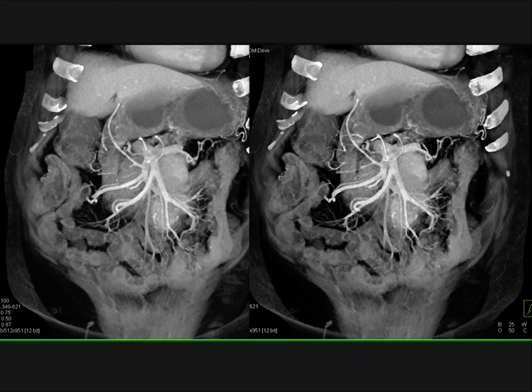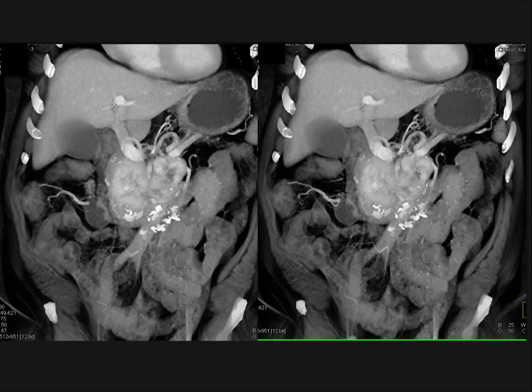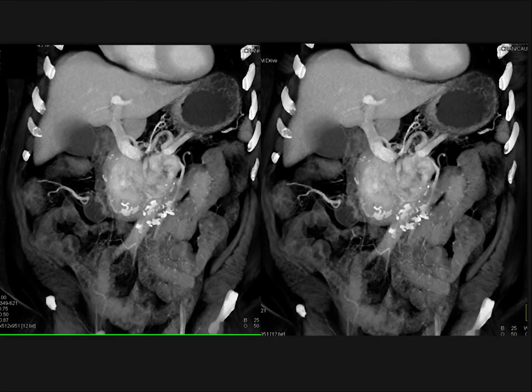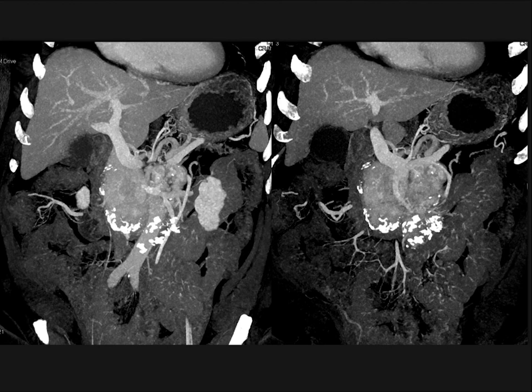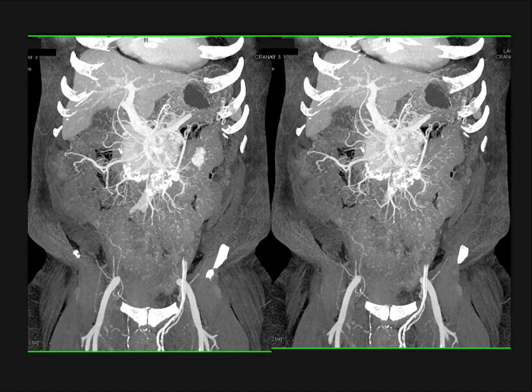And here it is again, just some additional images. So I think the appearance of these tumors is variable, from polypoid lesions to infiltrating lesions to bulky lesions with large necrotic nodes, with the nodes being vascular, nodes involving and including the patient's portal vein, and tumor having calcification. So again, beautiful example on venous phase imaging, and here it is with MIP.